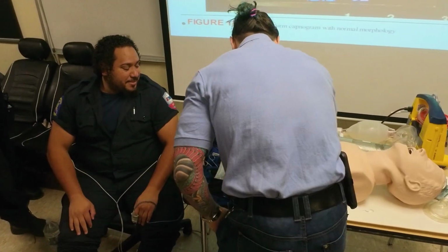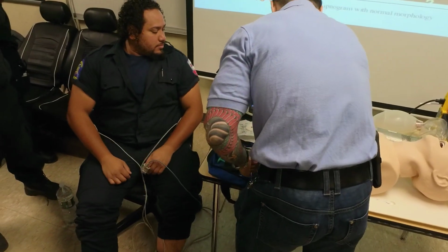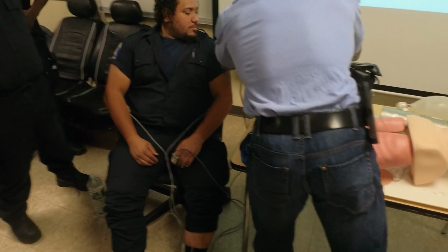Alright. So, this is good. Right, so we put a patient on pulse ox, and then the first one she uses.